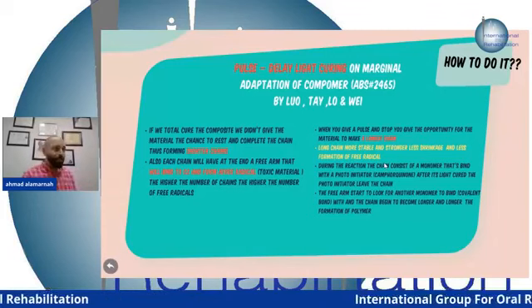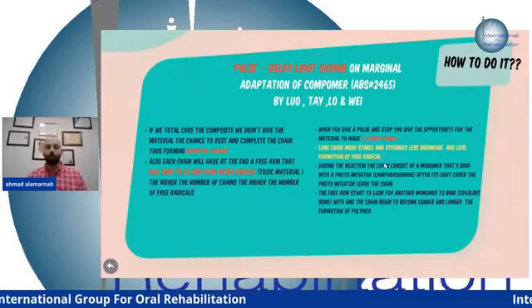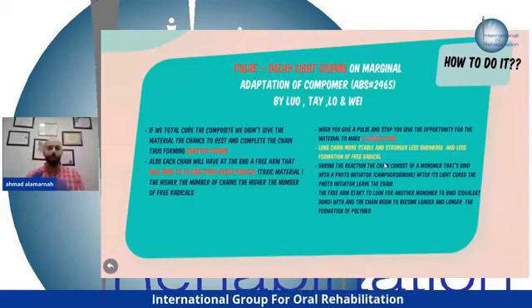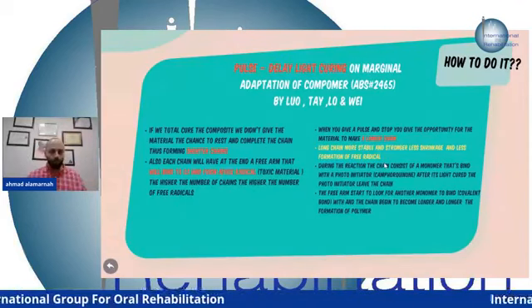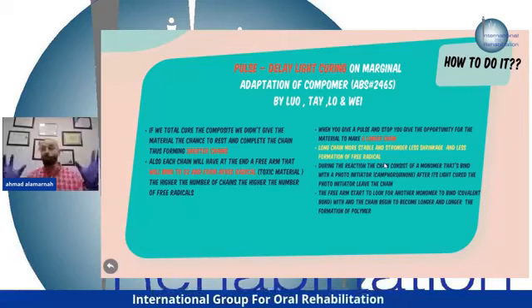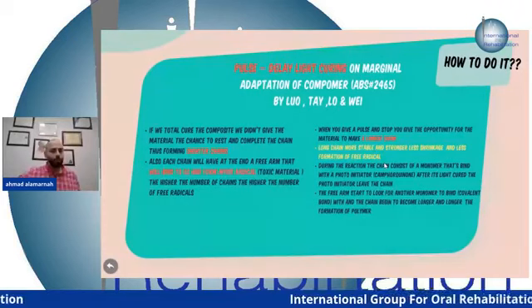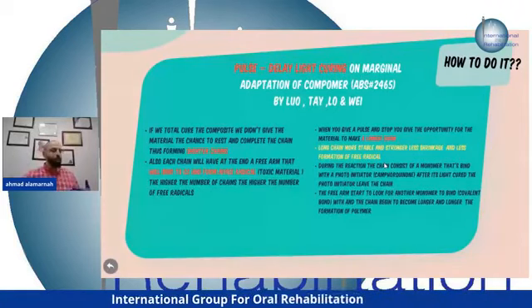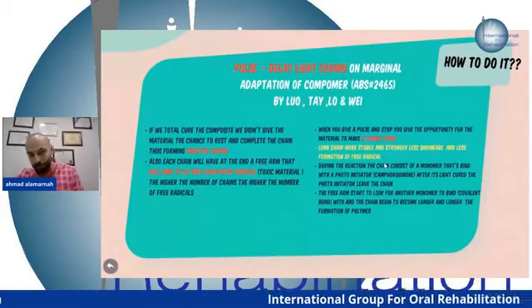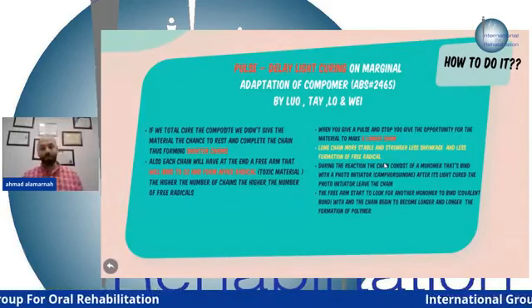Okay, so the traditional way that we all use is curing for 20 seconds. This is wrong because you shock the material. The material will shrink more and form a shorter chain. The polymerization is the chain formation, okay? The formation of a chain is the transformation from monomer to polymer. This is the idea for the hardening of the composite. So you need the longer chain, the more stable chain. The longer the chain, the more stable the chain, the less shrinkage, the less stress. So you have to deal with it with the light cure pulse delay technique, not an immediate shock for the composite material, okay?